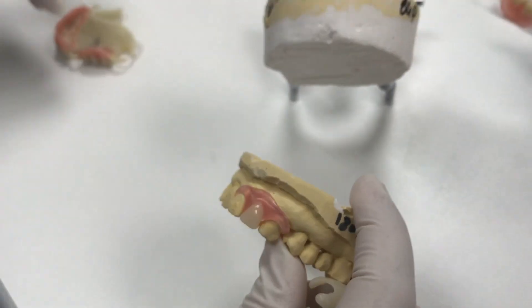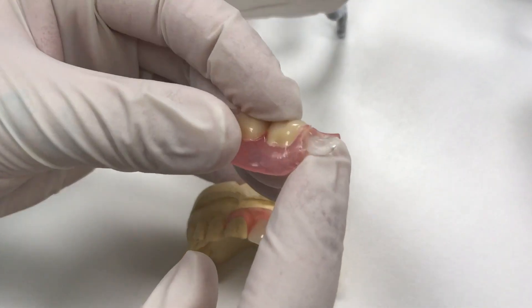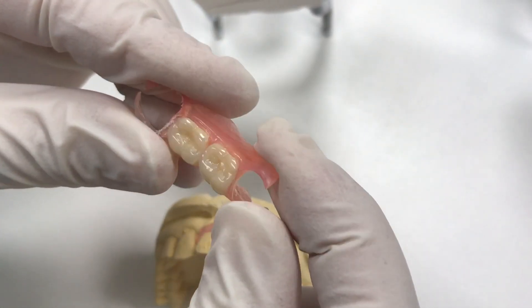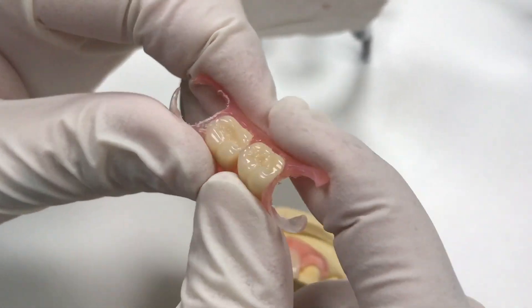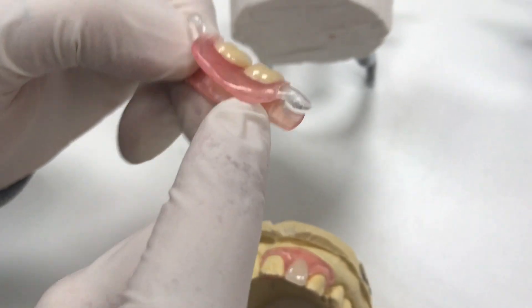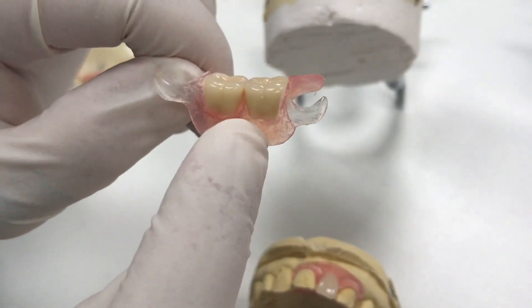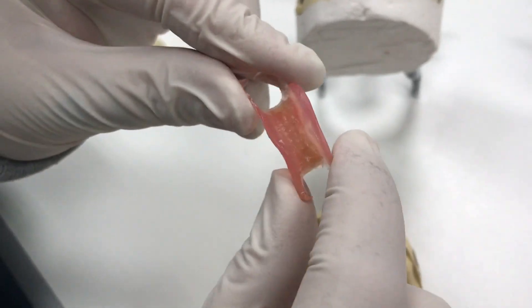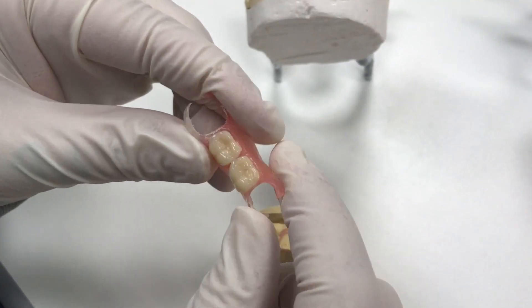We can do tooth-colored, we can do pink, and we can do clear on our flexibles. This is what we call a double shoot — it uses both types of flexible material from TCS: clear and the TCS unbreakable. We shoot our clear clasp first, then cut retention holes in them, invest the case, and then shoot the pink. So it'll pick up the clear clasp as well and become one underneath the tooth — double retention there.